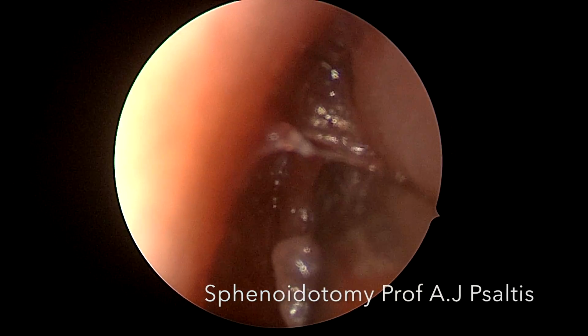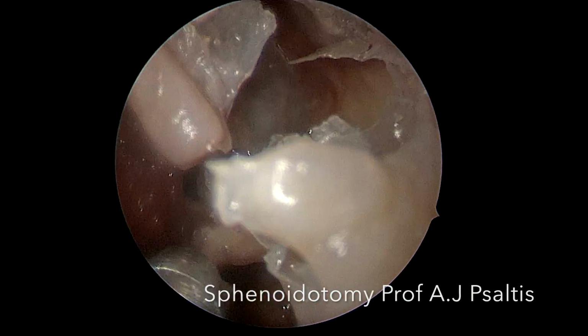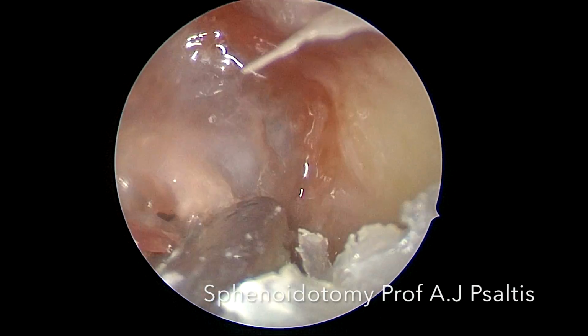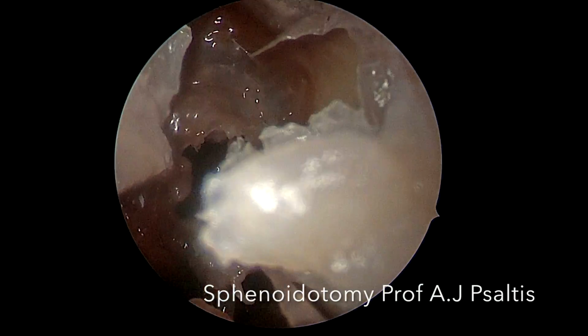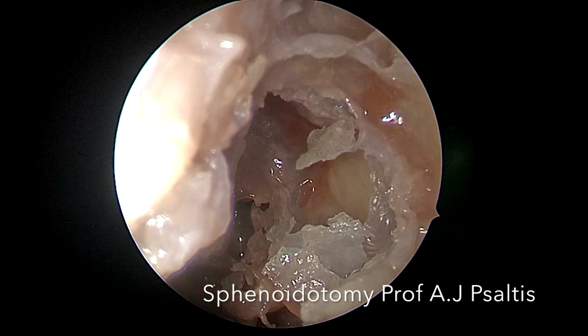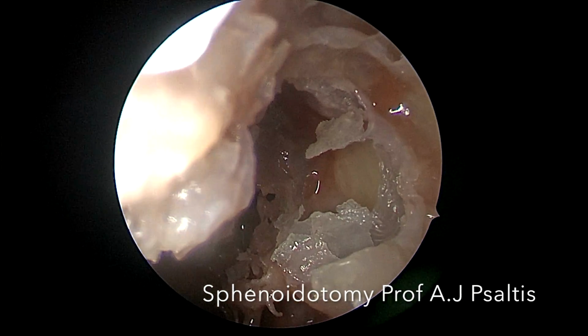It is safe to widen it first superiorly and medially, as the vital structures of the optic nerve and carotid artery exist on the lateral wall. We can then extend it inferiorly and laterally in an L shape.